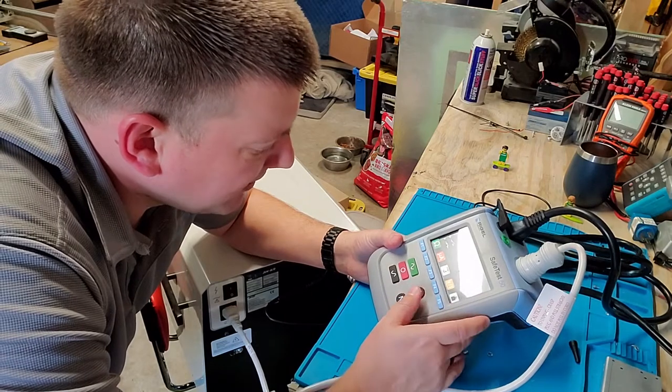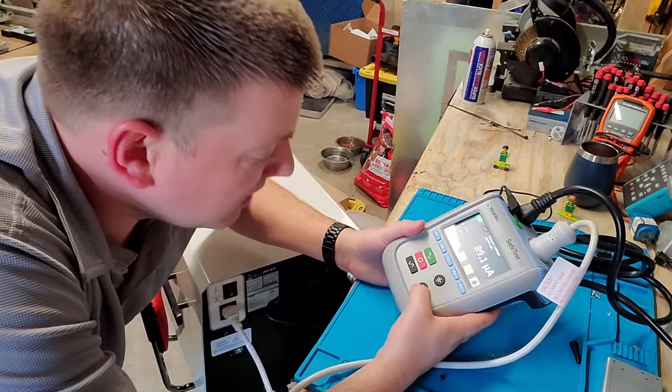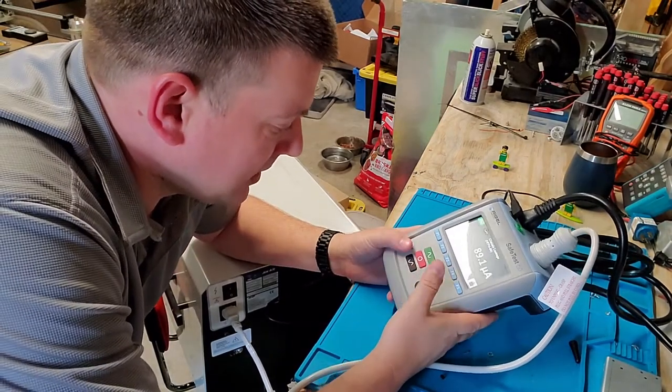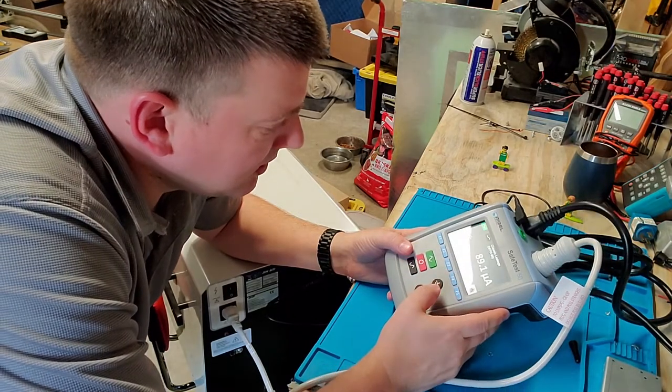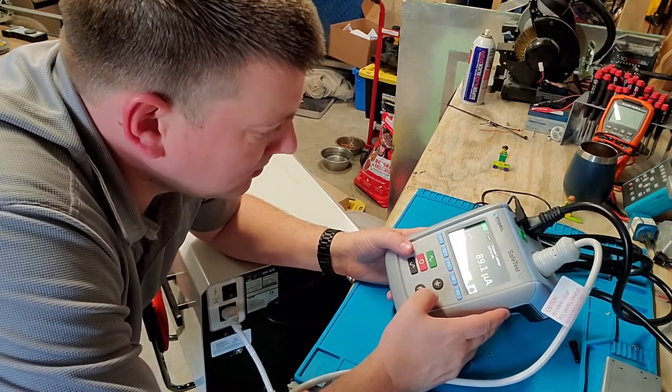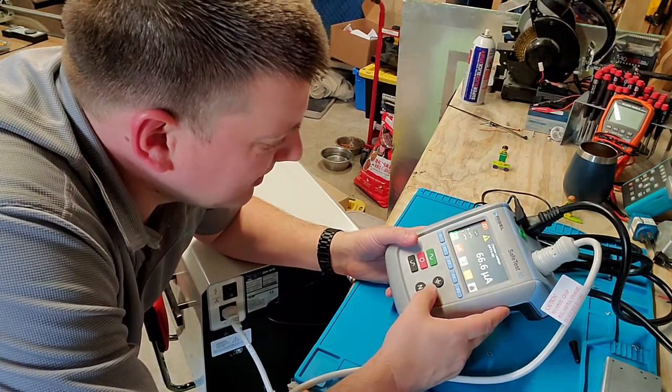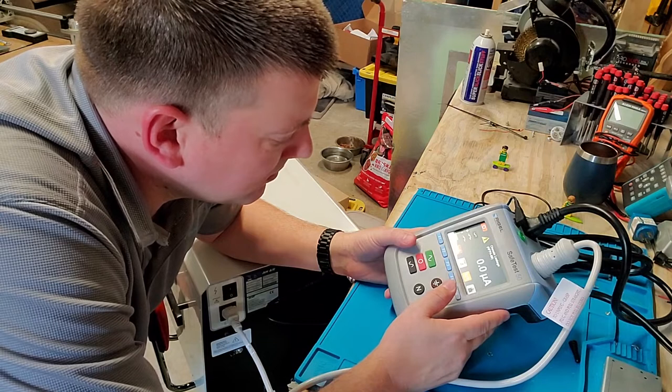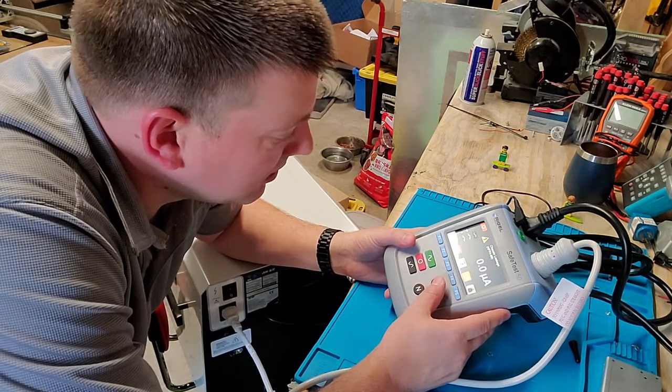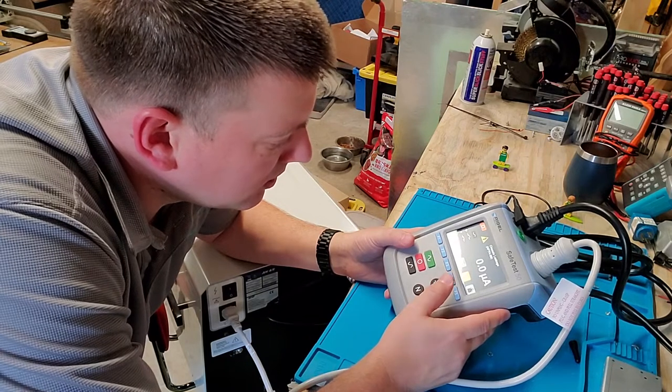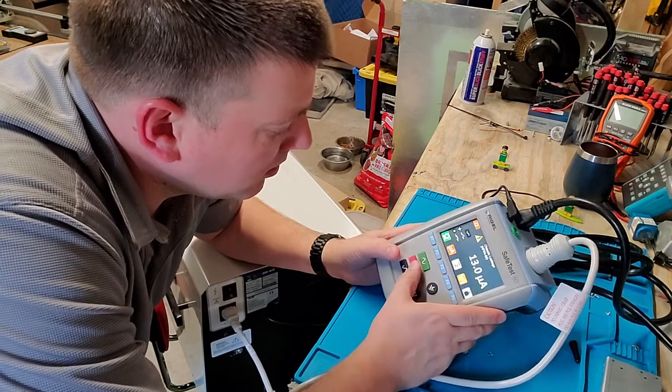This one here would probably get 88.8 written on the work order, no problem there. I tested that. Now here in the United States we don't have to do the open neutral and we don't have to do the reverse polarity. We can do it if we want. I hit reverse polarity. Here we go, we're going to open the ground. Actually close the ground, that was opened.